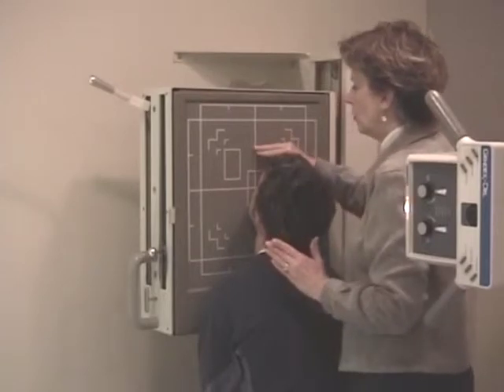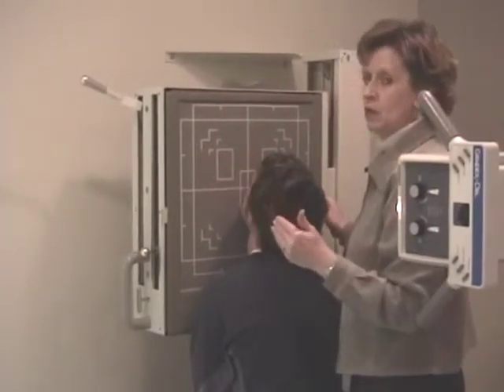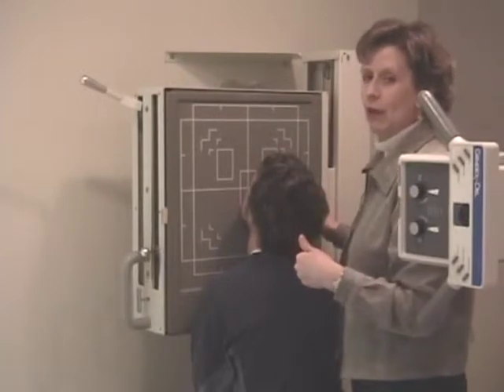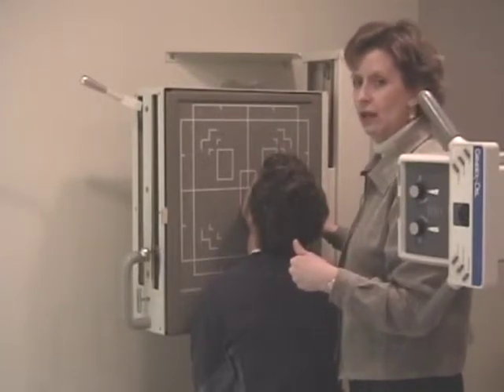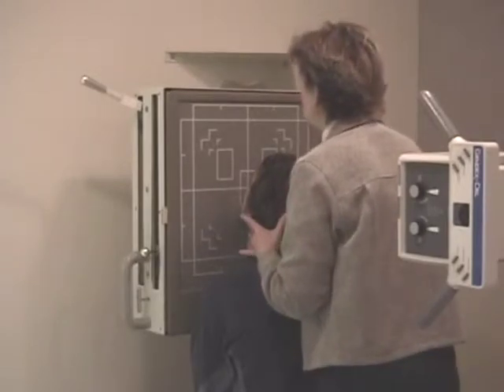Don't use the nose to evaluate if the patient is rotated or not. A good percentage of people have crooked noses. So look at the outer canthus of the eye and the lateral portion of the skull. Okay.